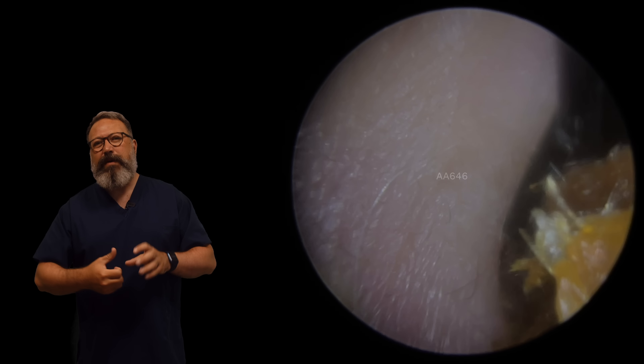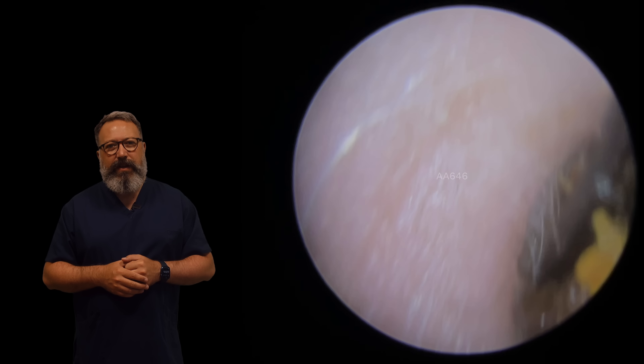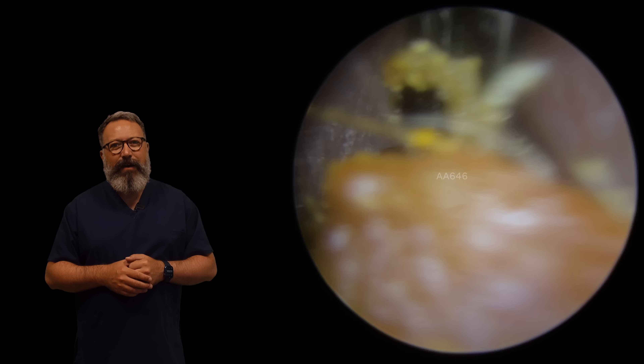You can see here we've got this strip of dead skin that's run behind it. So we're just going to jump on that now with the crocodile forceps. Let's start to pull this away. Look at that coming away there - you can see just how long that piece was.